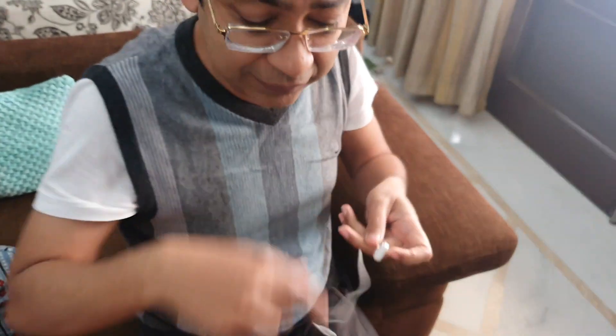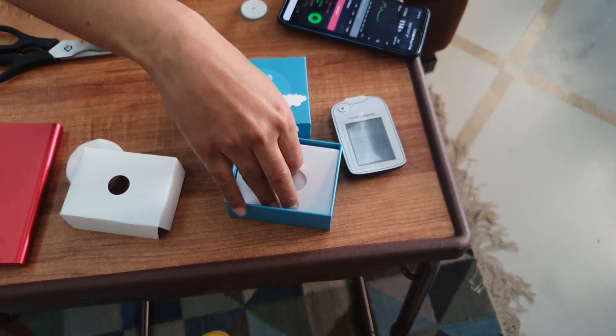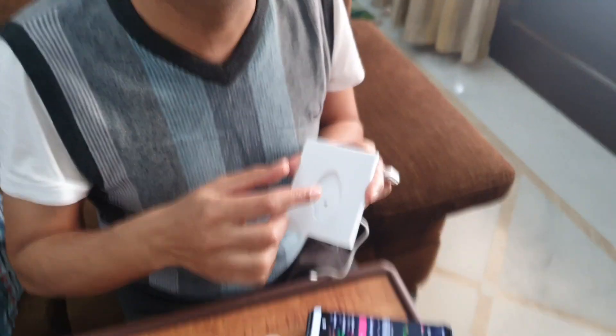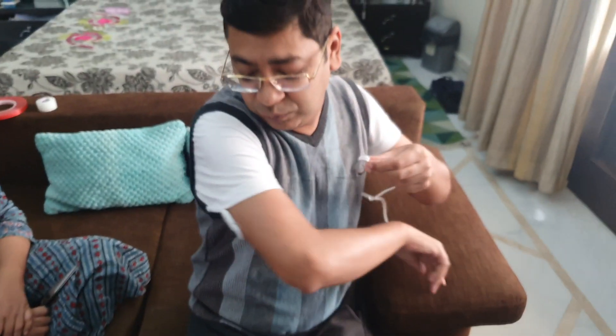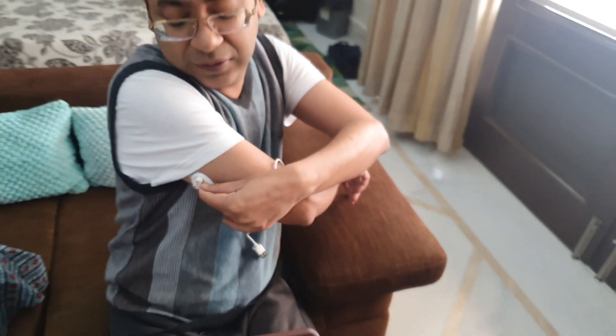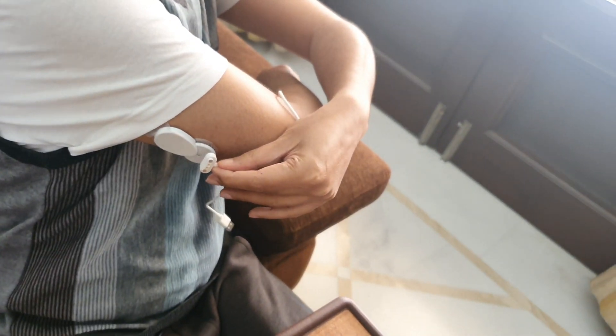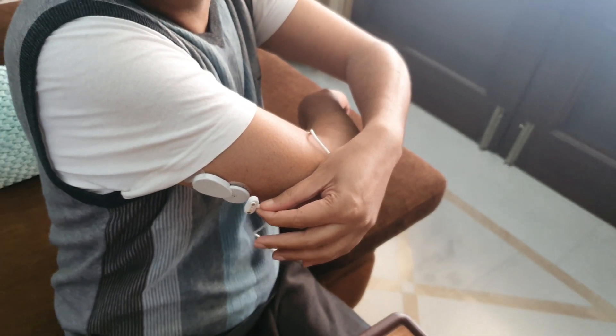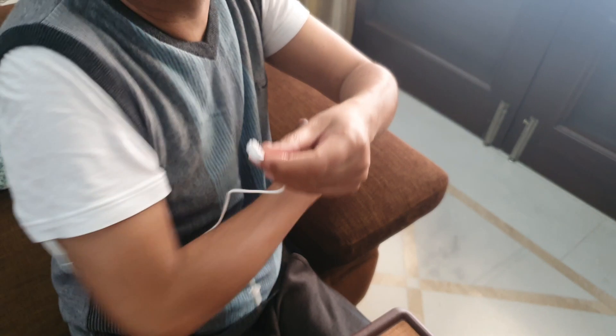Many people think that you need the small pin from the box to reset it, but you don't have to take it off. The back of the Bubble itself is a reset mechanism — just swipe it over there and you will see a light come on, which resets the device.